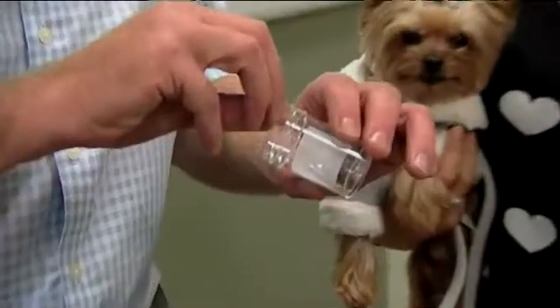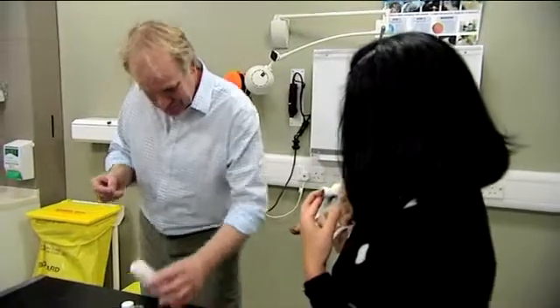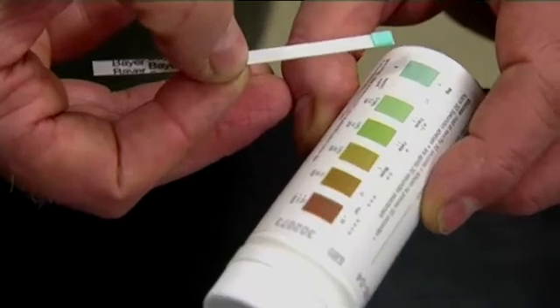So we'll pop this in, fingers crossed. We put that in there, and then we come up here and I read it, and I'm going to let you know later. Fingers crossed.